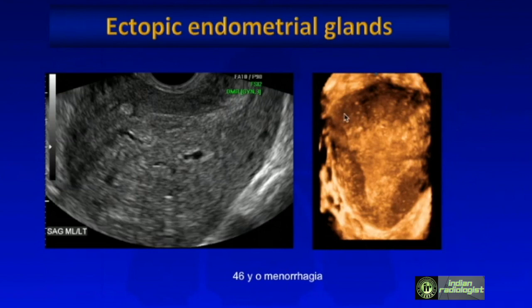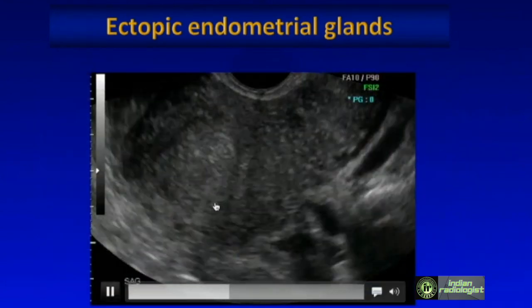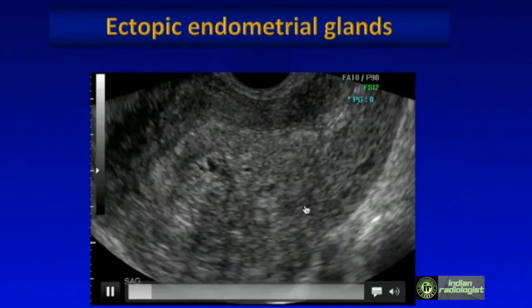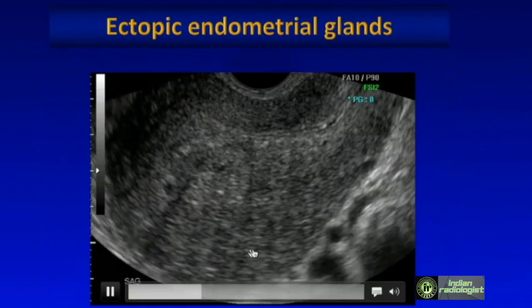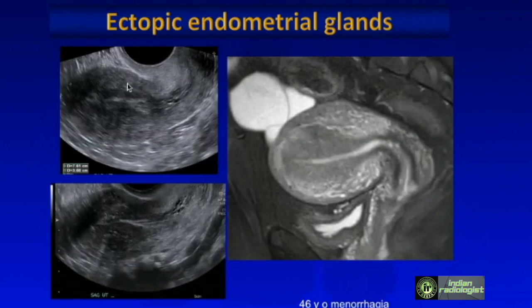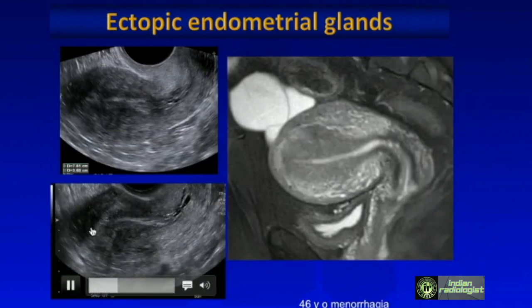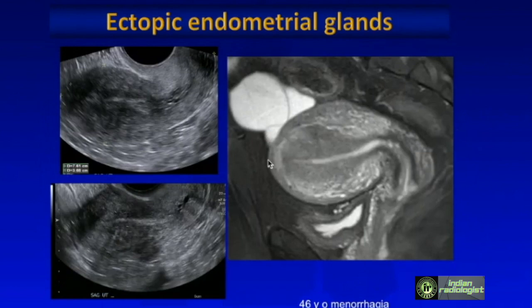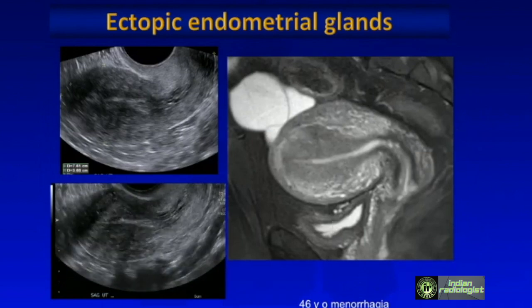You can see echogenic lines projecting from the endometrium into the myometrium, seen very well on coronal 3D reconstruction. On cine clips, you can appreciate all the echogenic nodules as well as cystic changes in this patient with extensive adenomyosis. This is a more subtle case showing thickening of the junctional zone, with cystic foci in the subendometrial region visible on the clip, and corresponding MRI confirming adenomyosis.